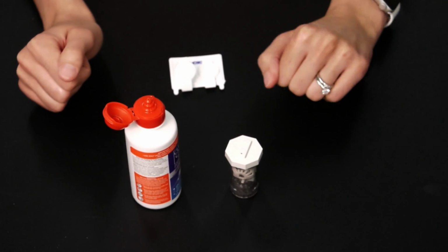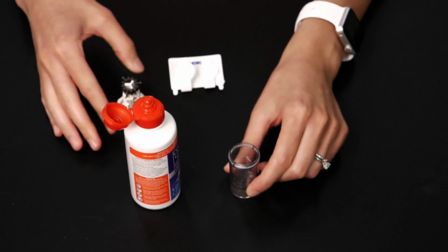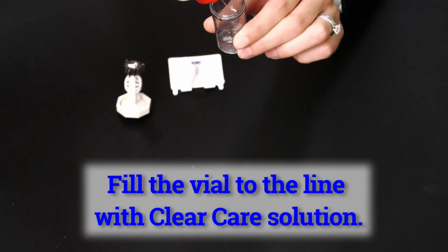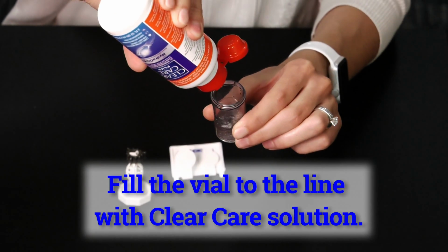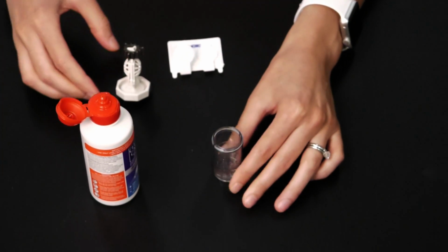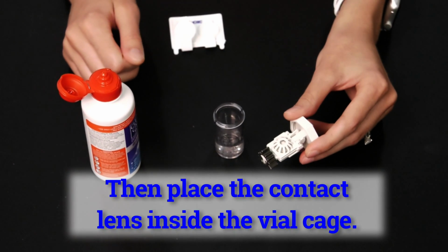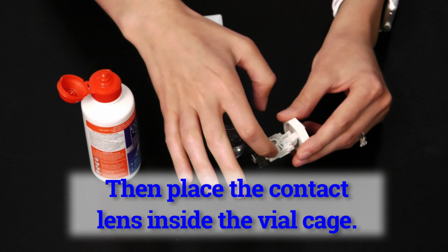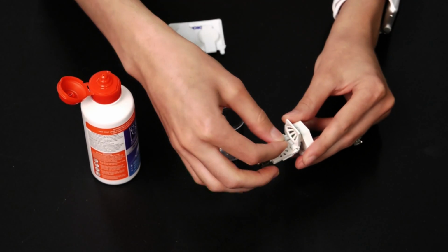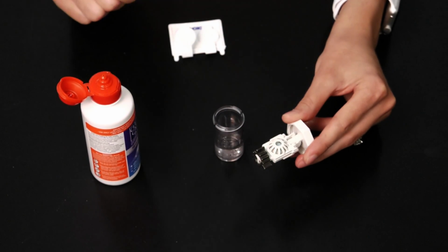To disinfect your contact lens with the Clear Care system, you'll open the vial and fill it to the etched line with the Clear Care solution. This solution never goes directly in your eye, it only ever goes in the vial, to be neutralized. The contact lens will then be placed into the Clear Care vial cage. The cage flips open, the contact lens is placed on top of the dome, and the cage is flipped down.